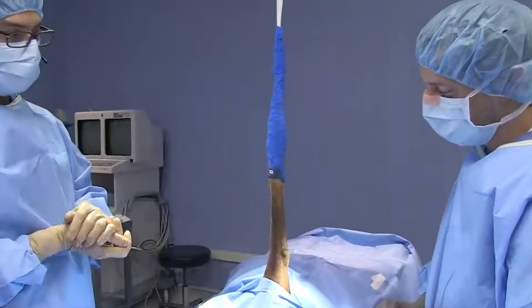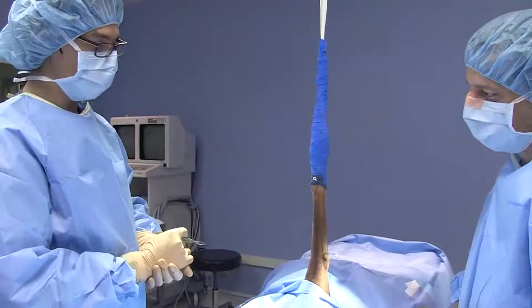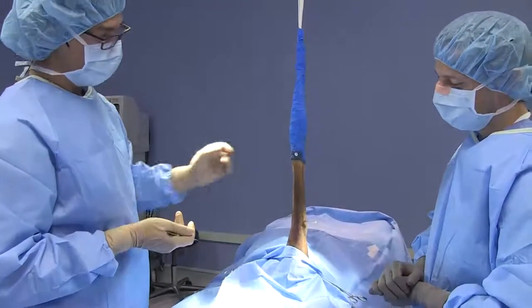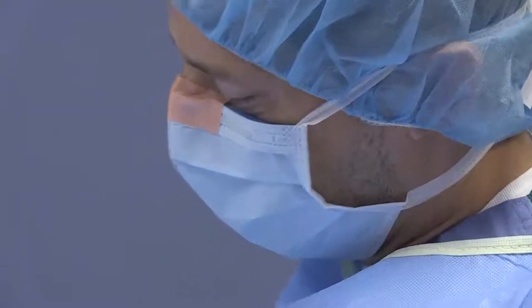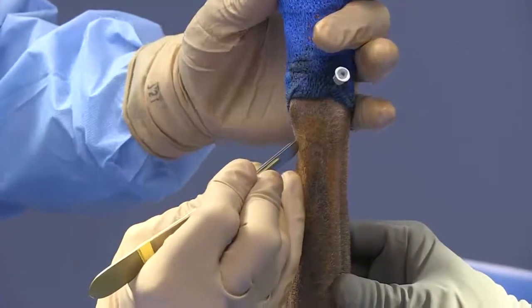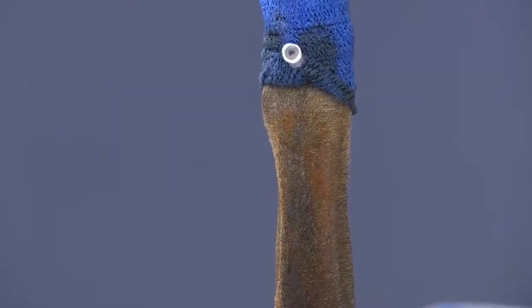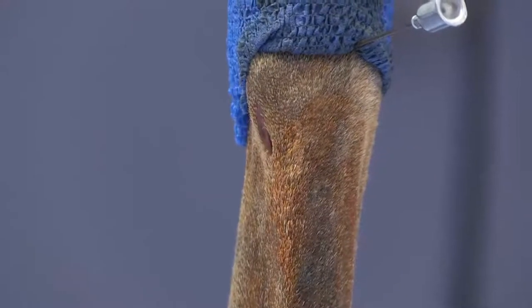The goal with the linear fixator is to avoid as much soft tissue as possible with pin placement. The radius is a good bone site because there are windows with very little soft tissue. Being aware of neurovascular structures and knowing your most superficial locations is beneficial. Generally, there are a couple of planes we can approach: cranial lateral or cranial medial for a type 1a. For a type 1b, we just place the other plane on the opposite side. We'll start on the cranial medial aspect, making a releasing incision — better a little too long than too short.